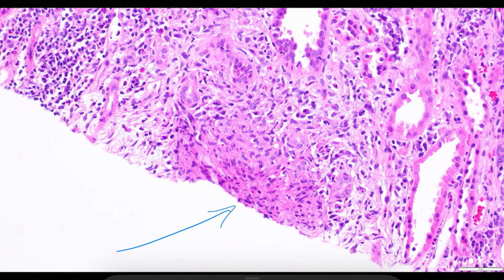Could this be related to the checkpoint inhibitor therapy? Exactly. So the differential of granulomatous interstitial nephritis is broad and includes drug/hypersensitivity reaction most commonly, one example of which is checkpoint inhibitor therapy related AIN. Other etiologic considerations include infections, particularly mycobacterial and fungal, autoimmune disease, and sarcoidosis, which is a diagnosis of exclusion. In this case, the AFB and GMS stains were negative for mycobacteria and fungal organisms, respectively, and the granulomatous interstitial nephritis was favored to be secondary to the patient's Keytruda use.